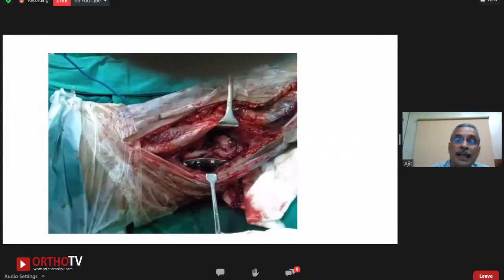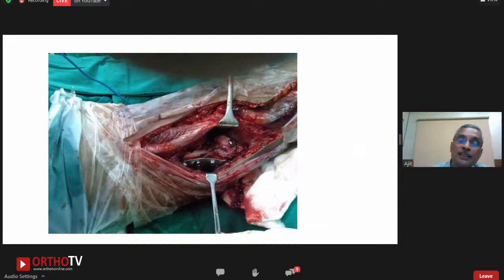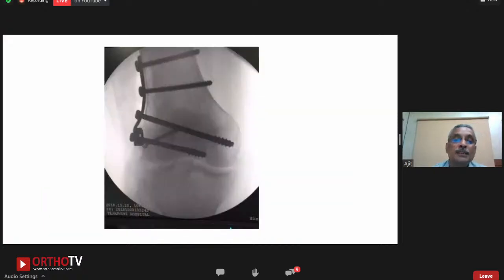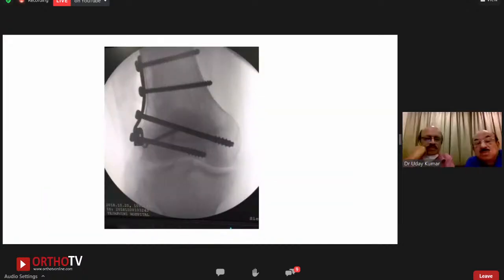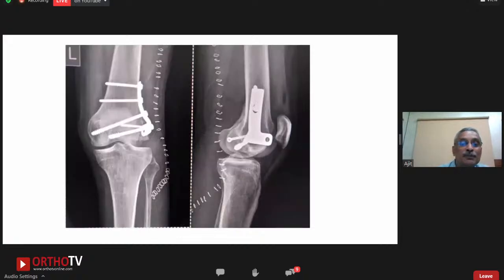And then went on the lateral side of the biceps tendon and put a plate. There you see the lag screws there where the K wires were. And this is the plate on the lateral aspect of the femur, lateral to the biceps tendon. So that was the fixation that was on table. Very nice. That's what was done. And I didn't use a small plate. I somehow like these old conventional AO plates. So that was the immediate fixation.